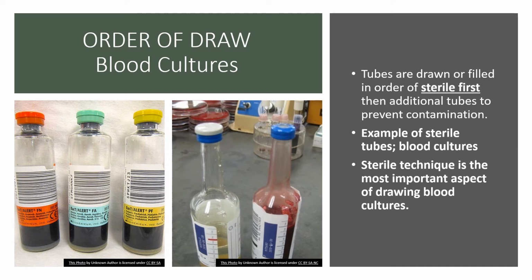The reason we draw it first is in case there's any air in any of the lines or tubes or needles, and some air gets into that blood culture tube, it's not going to make a difference, because that's the aerobic one anyway, and it is looking for bacteria that is okay with an oxygen environment.